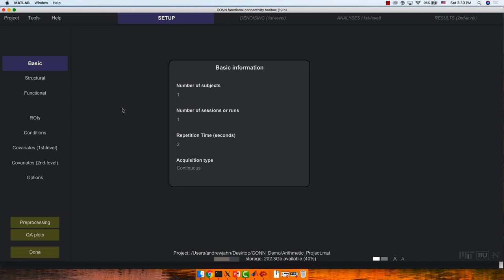Later on you can do more sophisticated things, especially with multiple sessions, multiple subjects, or a PPI analysis. For the repetition time, it was 3.56 seconds — you can find this on the website where we downloaded the data. The acquisition type was continuous, which is what virtually all your designs will use.